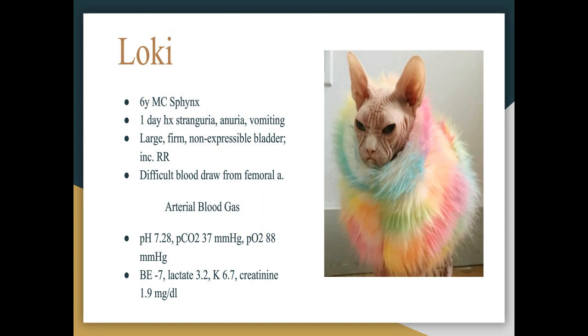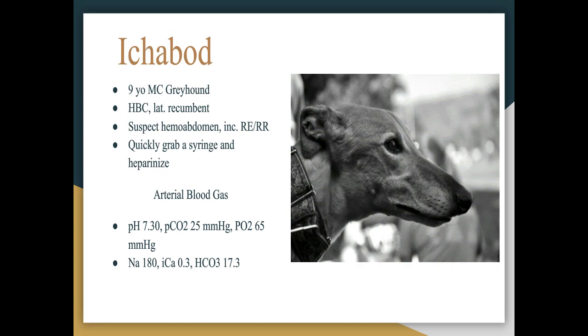Our next patient is Ichabod. He's a 9-year-old male castrated greyhound who's actually sitting right next to me as I'm recording this. He was hit by a car and presents to you laterally recumbent. On your physical examination and AFAST, you suspect a hemoabdomen. He also has an increased respiratory rate and effort, and you are worried about pulmonary contusions.